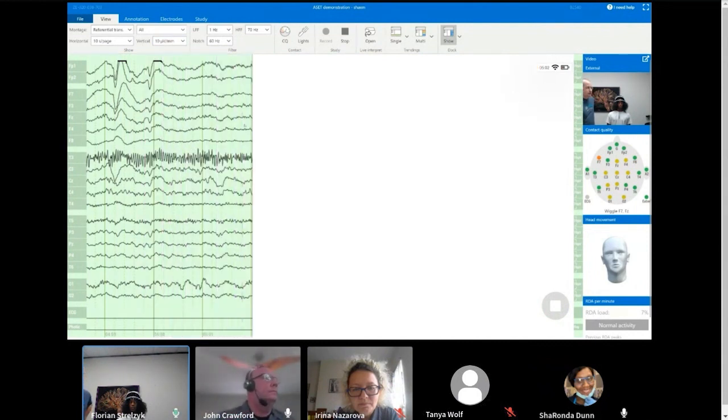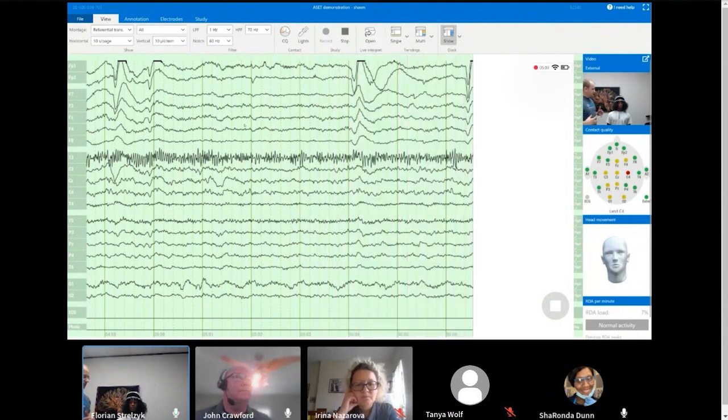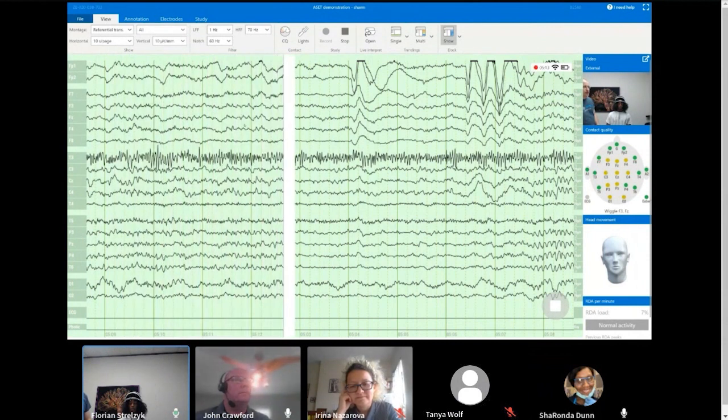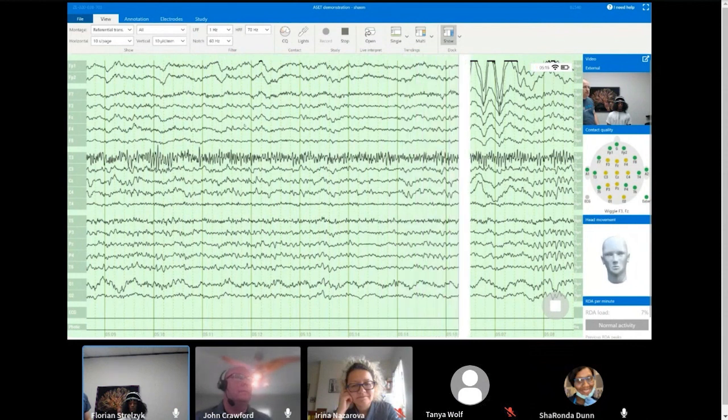And you see we're picking up some muscle tone on T3. So relax a little bit. Very good. Maybe that goes away. And then close your eyes and let's get some alpha. Alpha is a wave that your brain produces.